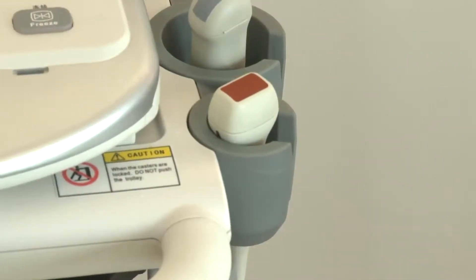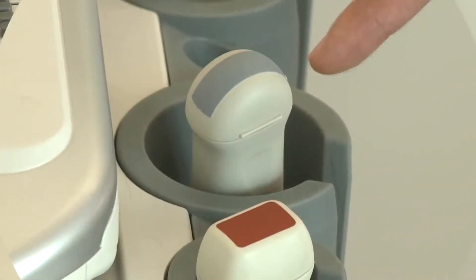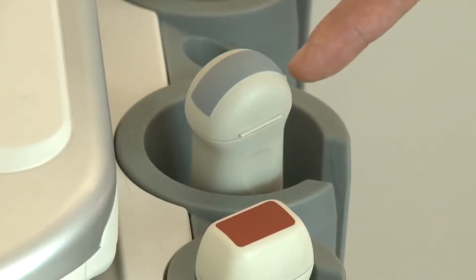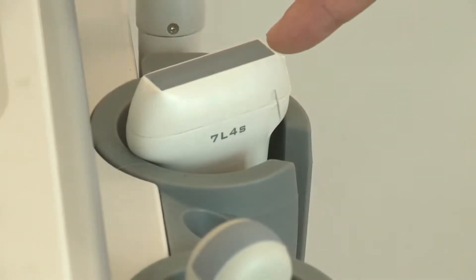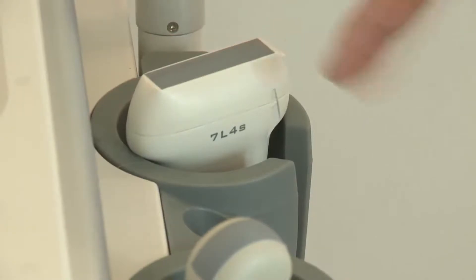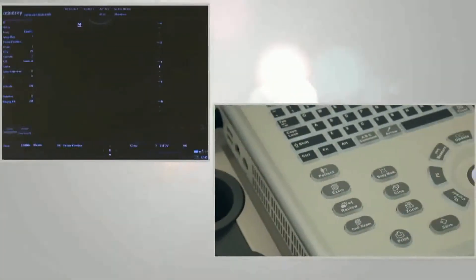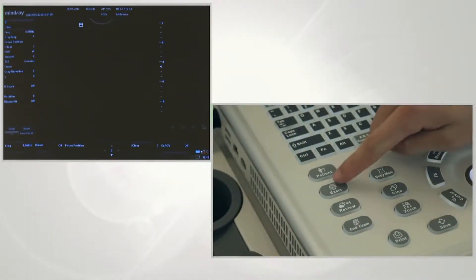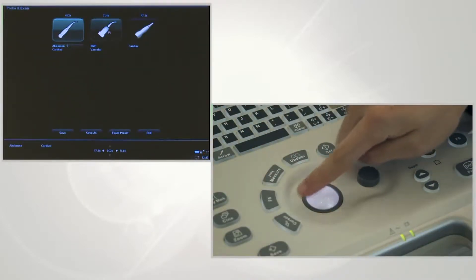You should choose the right probe according to different applications. Microconvex is used for small animal abdominal exams. Linear probes are for vascular and MSK exams. Phase array probes are for cardiac exams. Choose the right probe according to application, press the exam button, roll the trackball to select the right probe and application, then press set to confirm.